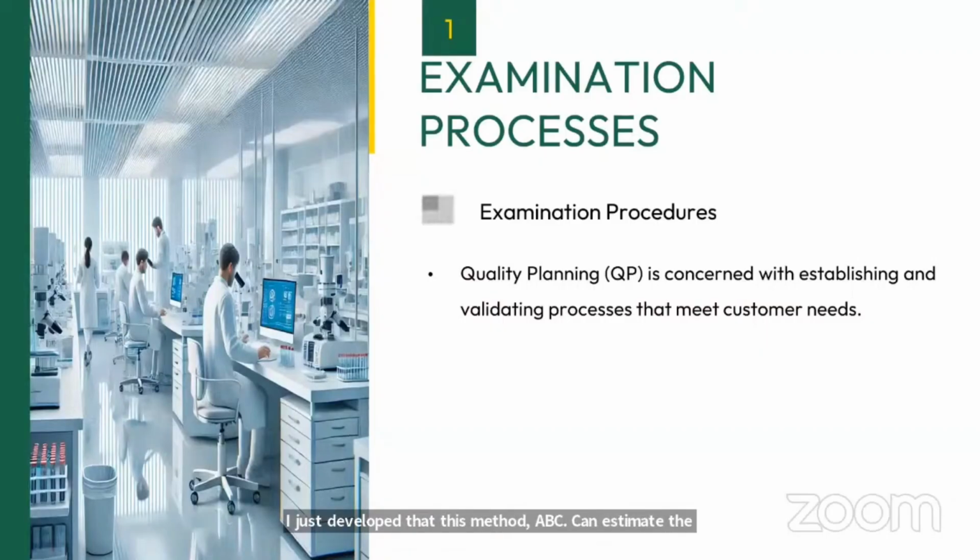So now I want to establish the claims. I want to know the sensitivity of this method. I want to know the accuracy of this method which I have developed. I want to know the precision of this method. I want to know what is the linearity, what are the interferences, what can be the other applications of this test, how far it will be reliable, what type of samples is required, whether it requires blood samples, whether it requires any specific serum samples, or whether it requires any specific plasma samples. So all these I need to establish.